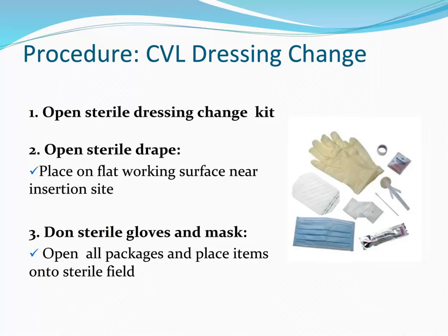Let's review some important points about CVL dressing changes. Because this is such an important part of reducing infection, we need to treat each dressing change as a procedure, not just a quick task. First, be sure to use a dressing kit. It has all the supplies you need to maintain compliance with proper procedure. Make sure your hands are clean before you begin. Open the sterile drape and place it on a flat working surface near the insertion site. Please be certain to always wear a sterile mask and sterile gloves.